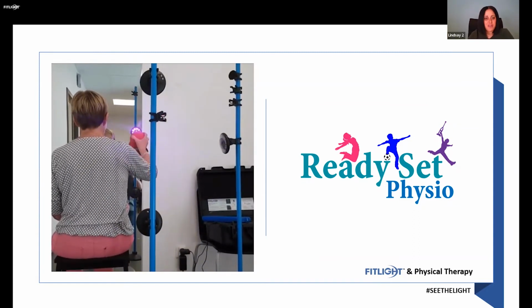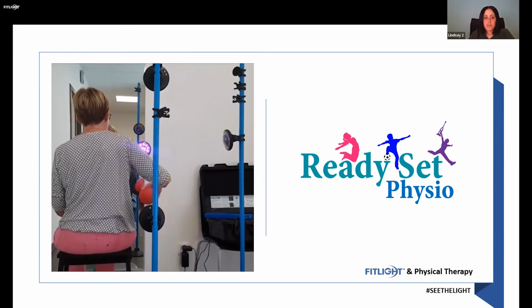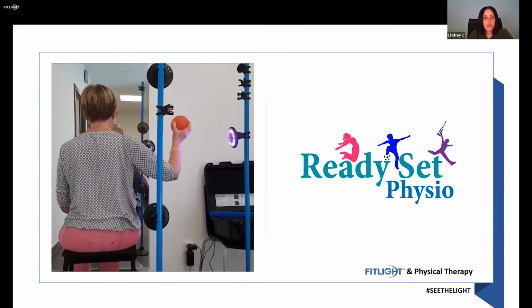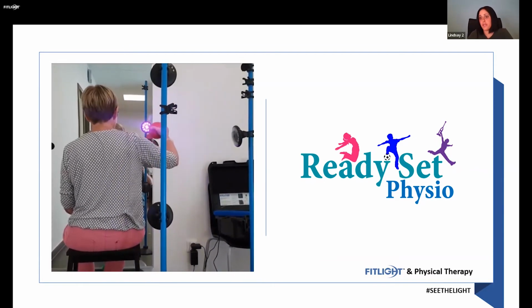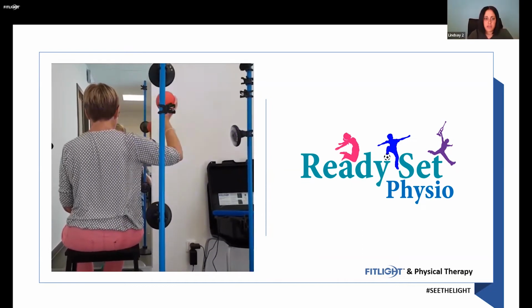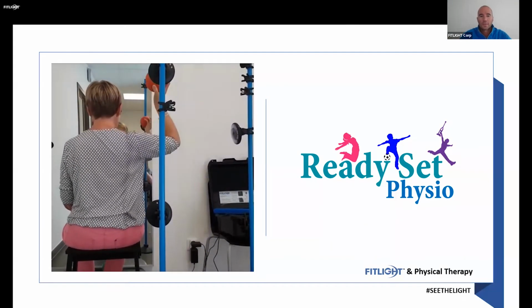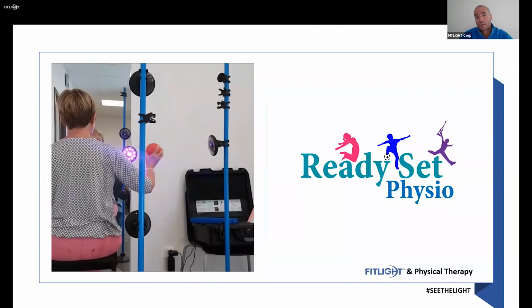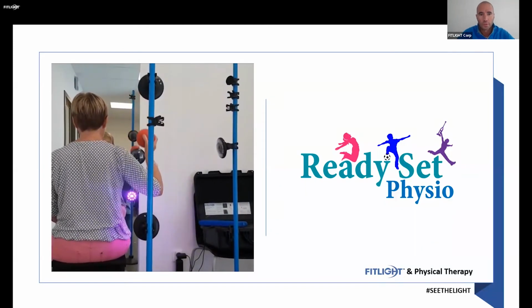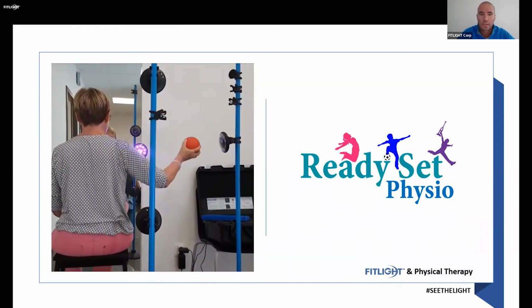This could be something that you might start with just doing a 30-second drill until they build up their muscular endurance. And then as they're more comfortable and they've got more strength and endurance, you could say, okay, we're going to do this for a minute now and see how you do. And then you can compare it to their unaffected side. You say compare because obviously the data that you get from this is your average reaction time, your total time, and the number of deactivations that you do, let's say within 30 seconds, like you mentioned.